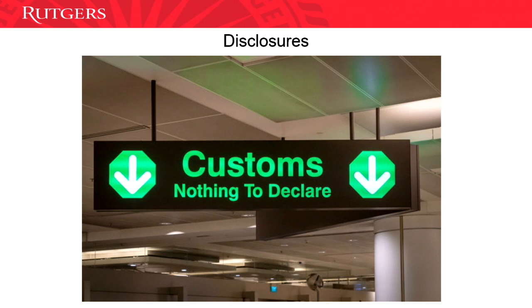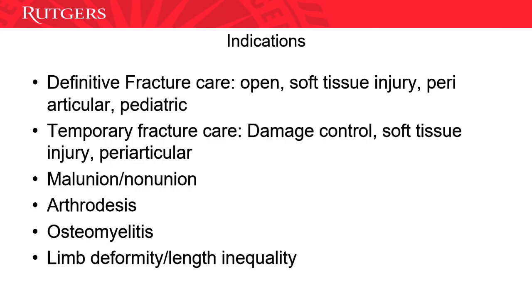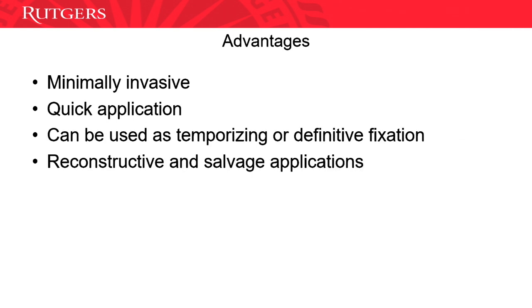I think my colleagues before me went over a few things, and I had some idea they might do that, so I'm going to breeze by a few things of just what the indications are. As we mentioned, it can be definitive, temporary. It can be used for arthrodesis, infections, limb length as well. I know this is mainly a trauma talk, but these are things which you can use X-fix for.